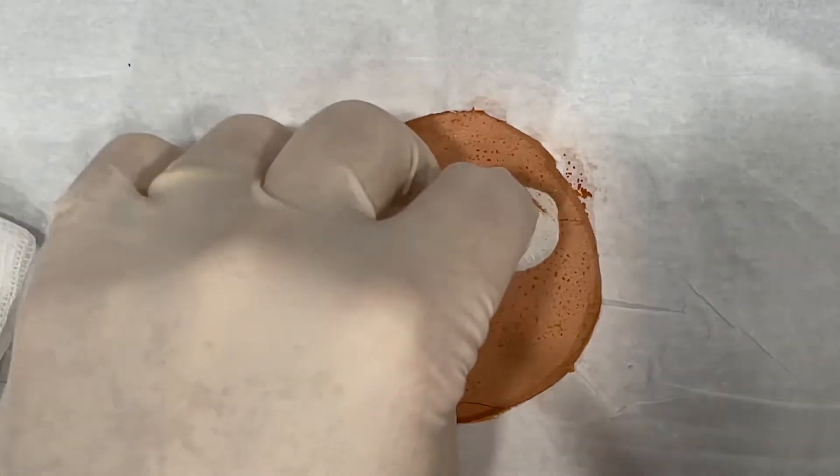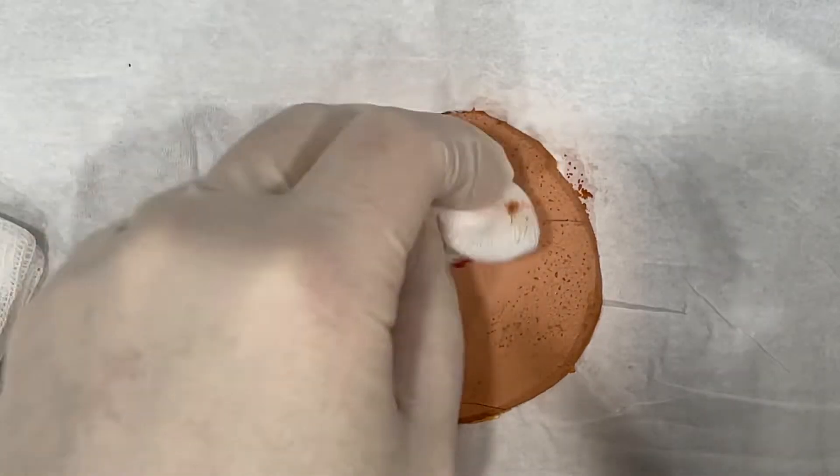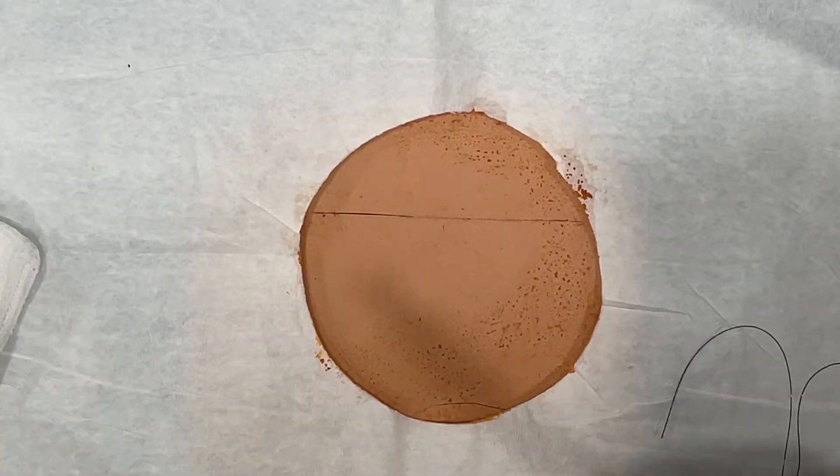Hey guys, we're about to knock out a simple suture with an instrument tie. Pretty clean cut laceration. We're going to use a 4-0 nylon with a reverse cutting needle.